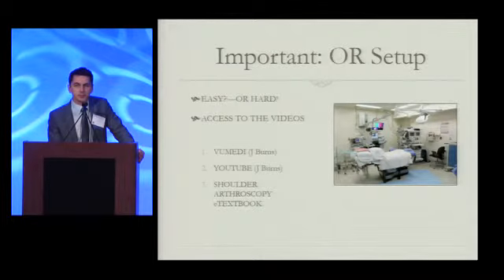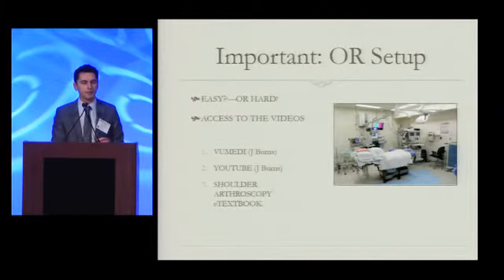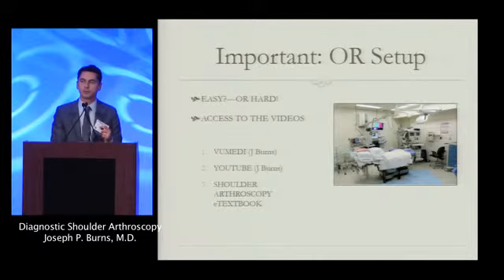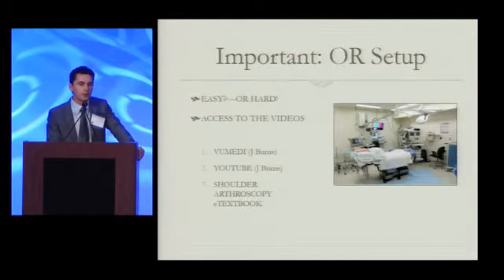So OR setup, Dr. Trenhill did a great job of that. It can be really easy, especially if you're starting out and someone does it for you. But if you're doing it yourself, it can be quite difficult. Most of us that are experienced have our own situations that we've got set up. We've got our own patterns, and it may not be an issue. But there is some help out there. We spent some time creating some videos, accessible to anybody, that go over how to set up for a shoulder arthroscopy in a very organized fashion, in case you're struggling with that. It can be very difficult to change the atmosphere in an operating suite or a hospital. If they're used to doing things a certain way, it never works, and you've got a better way to introduce. So spend some time on maximizing your OR setup.